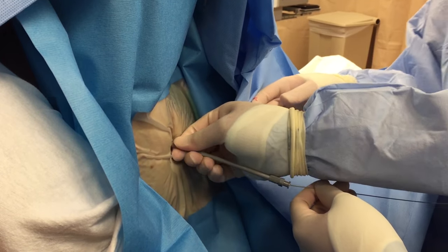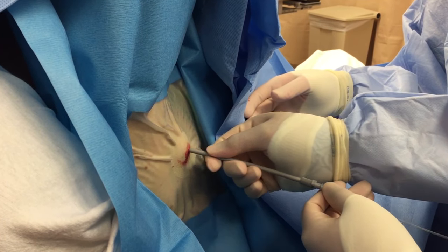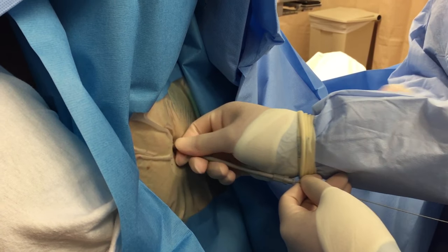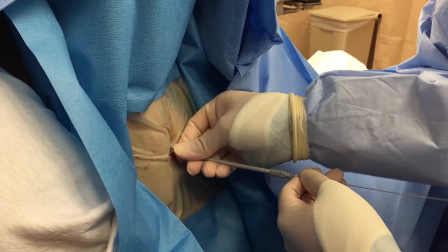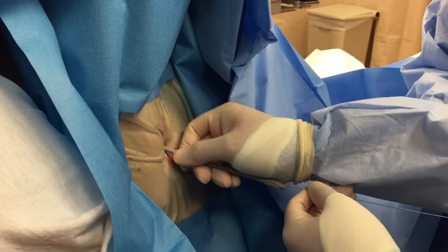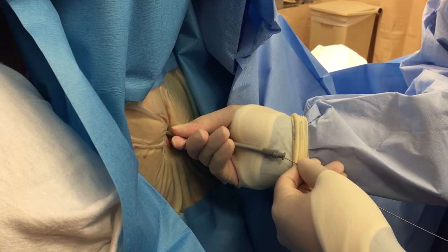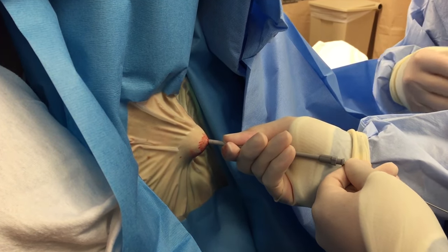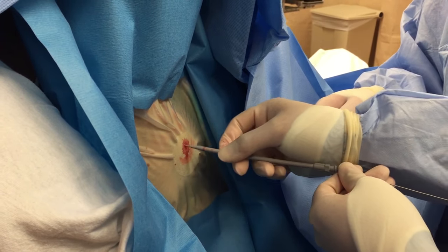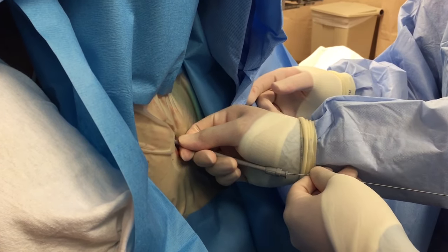If you're reaching a lot of resistance, you always rack your wire to make sure it moves freely. What you're doing is making a track for yourself. But when you're pulling back out, you're holding the tension on the twist so that you're actually ripping fascia. Your wire never moves out — your dilator moves over your wire. That's the one that does it. Do that again, see if you're free now. Keep going then.